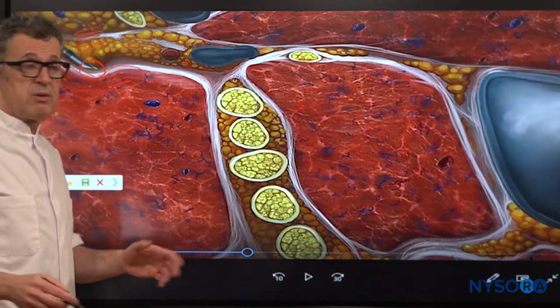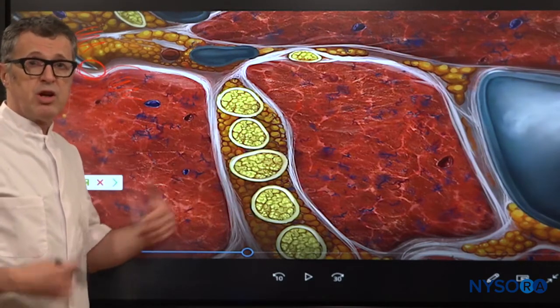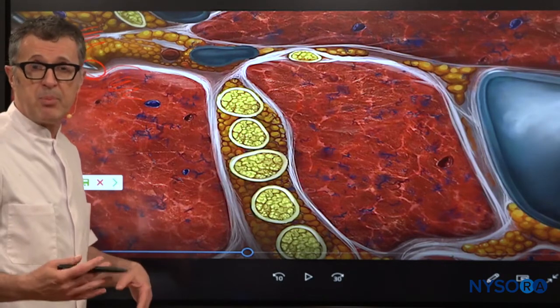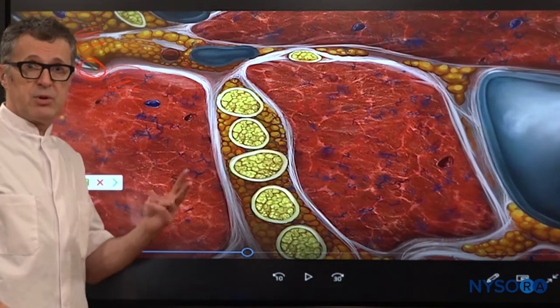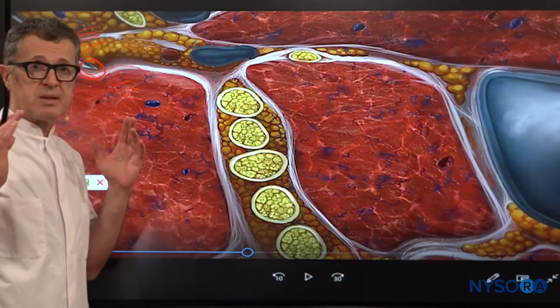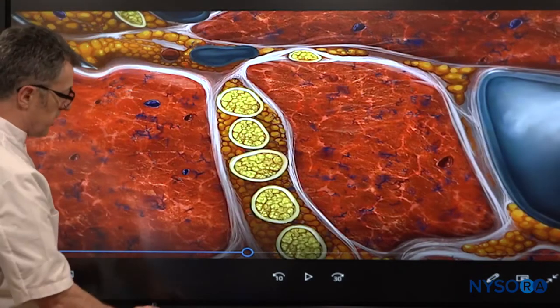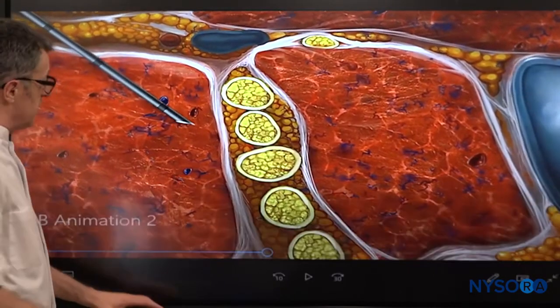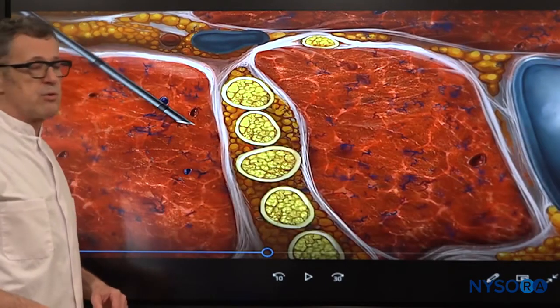For that reason, when you penetrate the fascia, two things happen. Number one, you oftentimes perceive a pop or a click because you penetrate that tough layer. And number two, the needle tends to pass somewhat uncontrollably. So let's watch that. As this fascial layer, the cervical fascia, gives in, you could see how the needle tends to penetrate without control a bit.